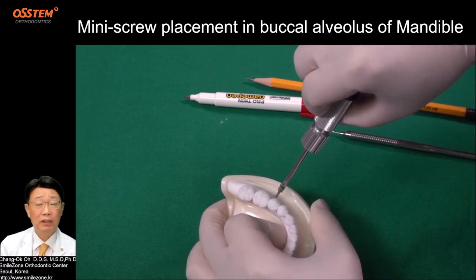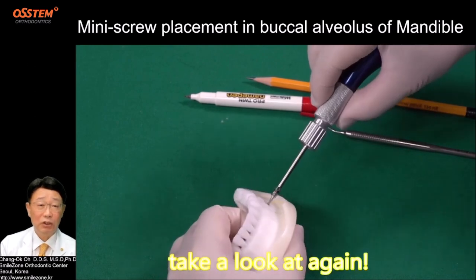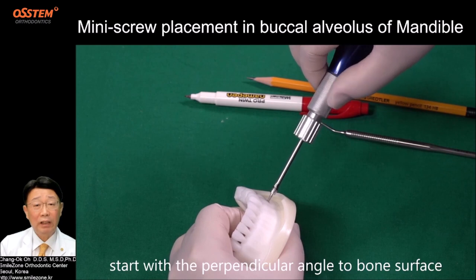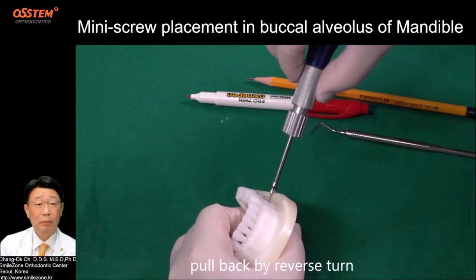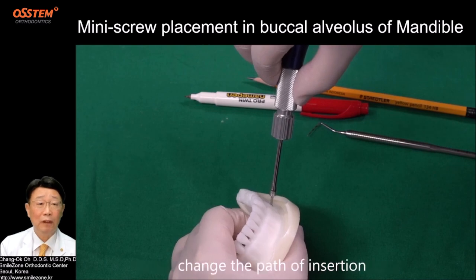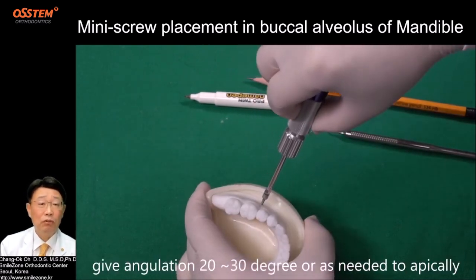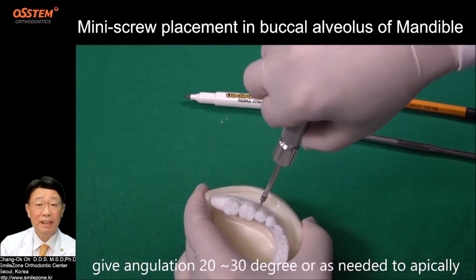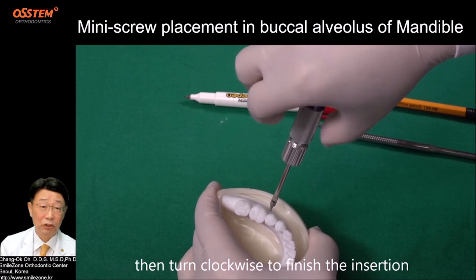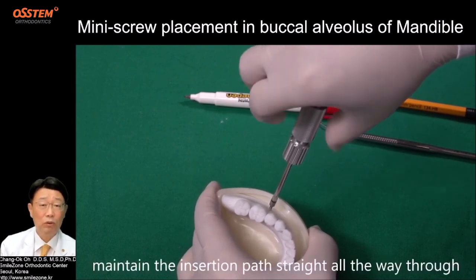Step 6: Finish the insertion. Turn the driver clockwise to finish the insertion. Start with a perpendicular angle to the bone surface, then pull back by reverse turn to prevent breaking the tip of the screw. Change the path of insertion, giving an angulation of 20 to 30 degrees apically as needed, then turn clockwise to finish. Maintain the insertion path straight all the way through.